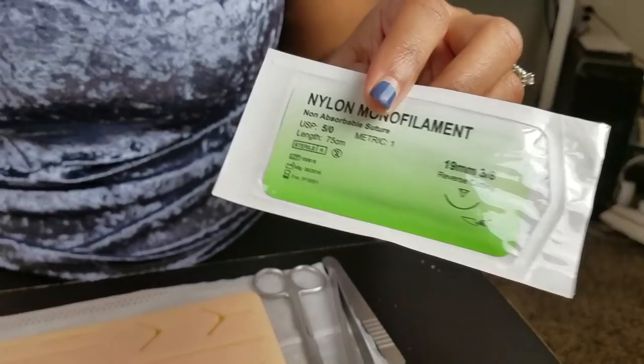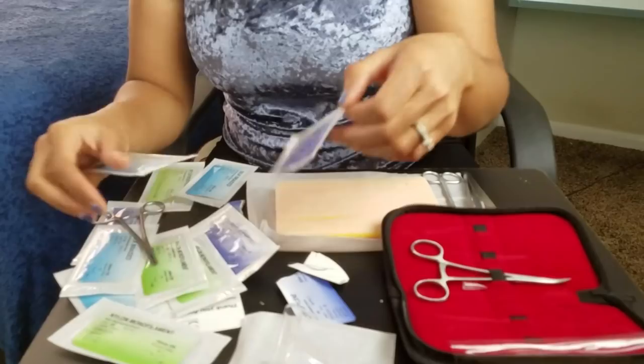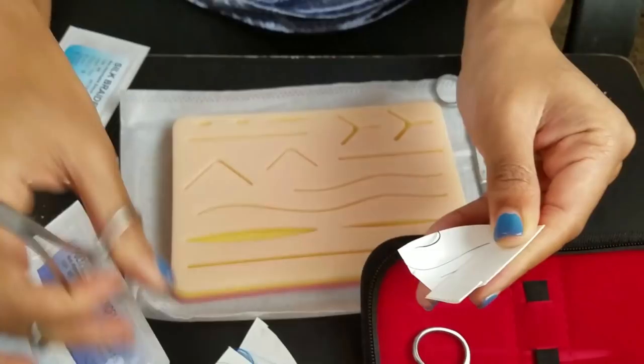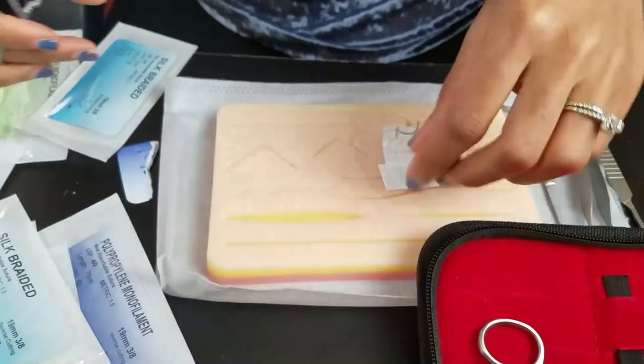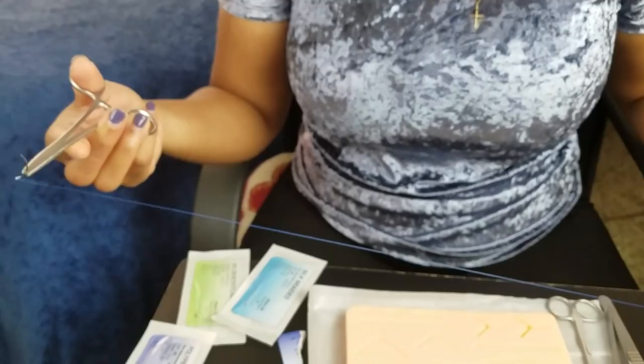Do you see the difference? So let's put that up there so you can see — larger needle, a little bit of a larger thread, smaller needle. Proline is usually blue. It's really nice for facial sutures and things of that nature because it's easy to see. So when somebody has to come through and remove your sutures, it's easier for them to see those blue sutures than a black suture, because black gets all crusty and dirty in the wound.